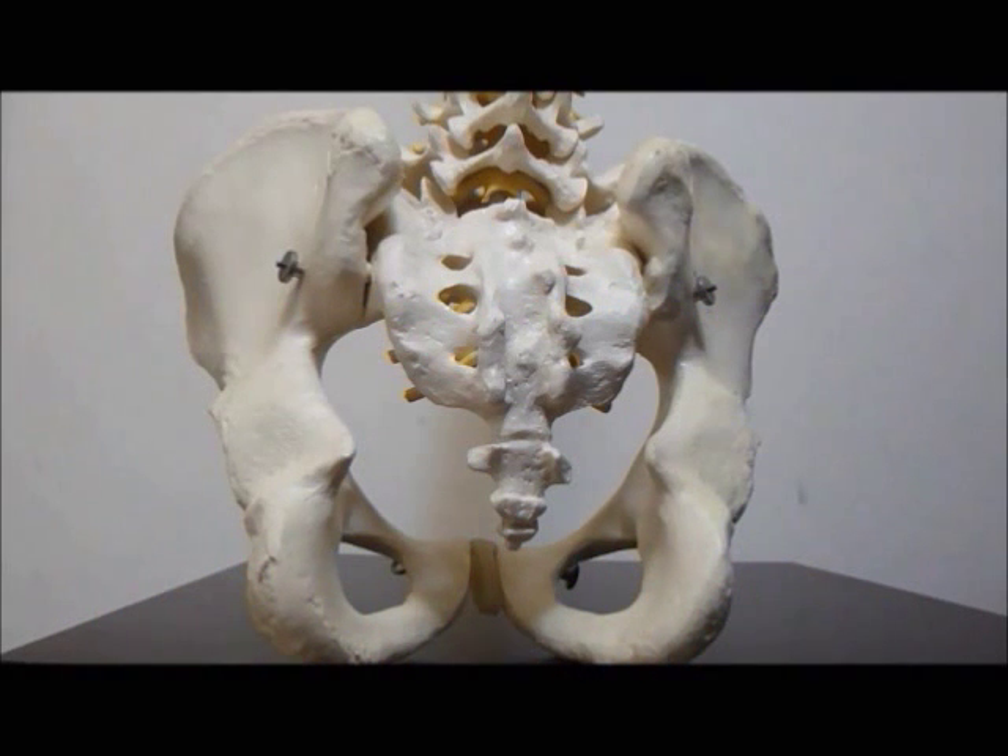Ladies and gentlemen, in this video clip, we will demonstrate to you how ultrasound guided sacroiliac joint injection is performed.